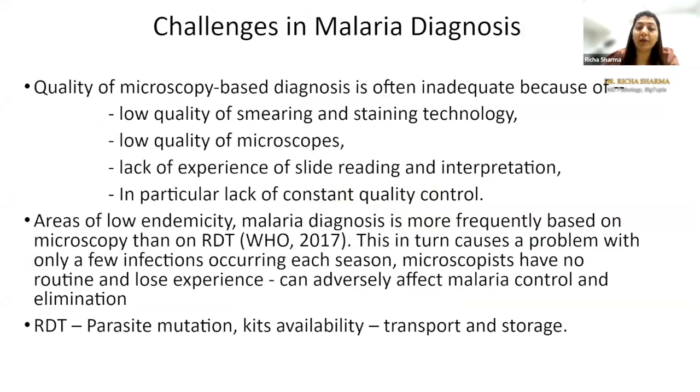Like I said, the quality of microscopic based diagnosis is inadequate. I'm not just talking about the man behind the microscope, that I've spoken enough. Even the quality of smearing and staining is variable across different labs, different cities, different countries, and also the quality of microscopes that we use.